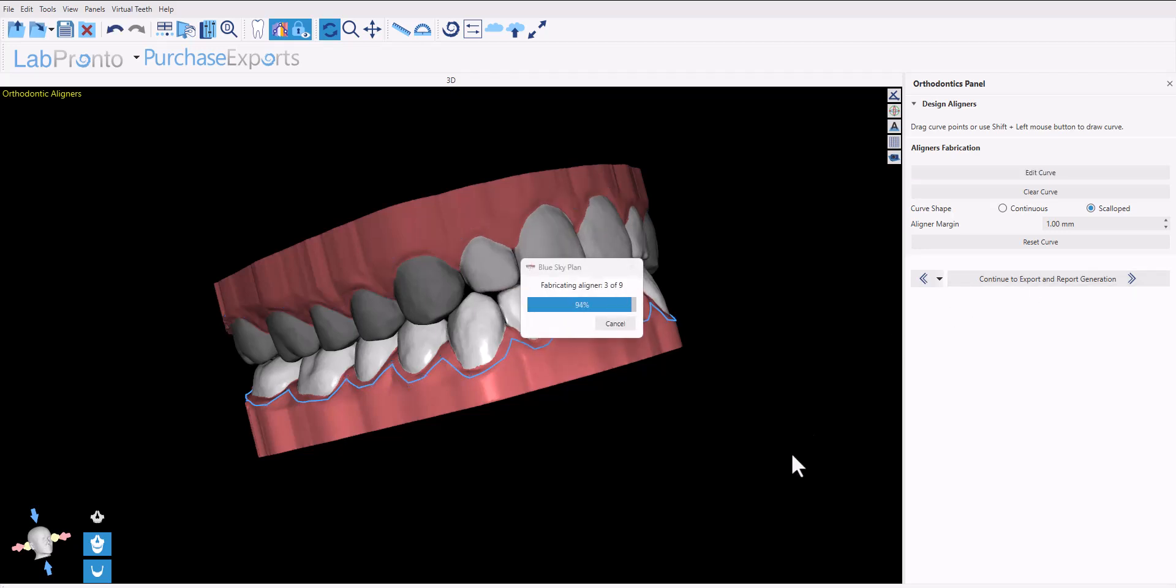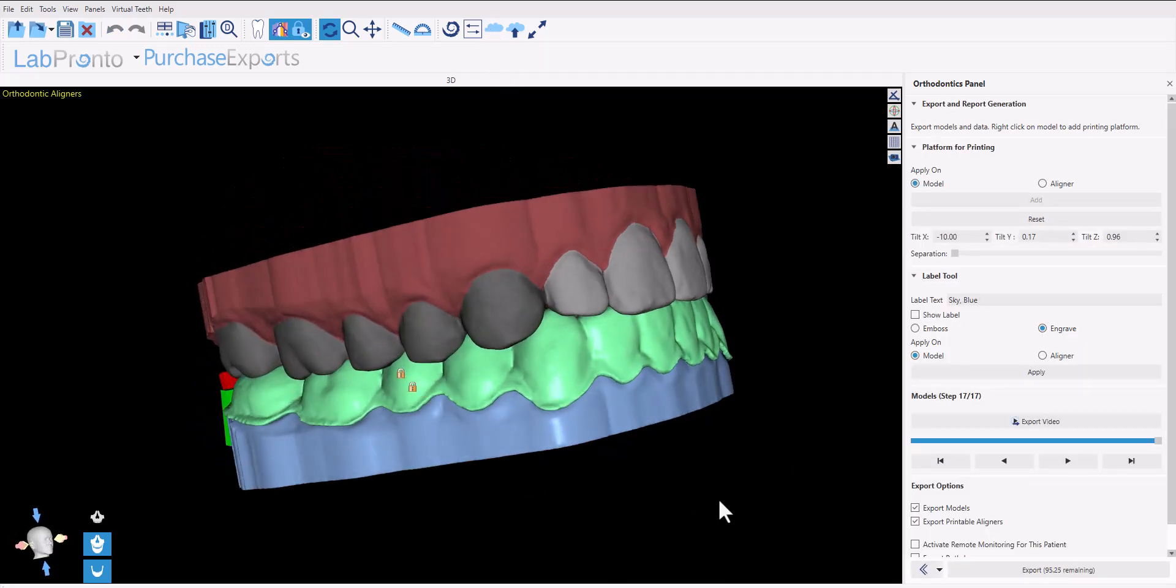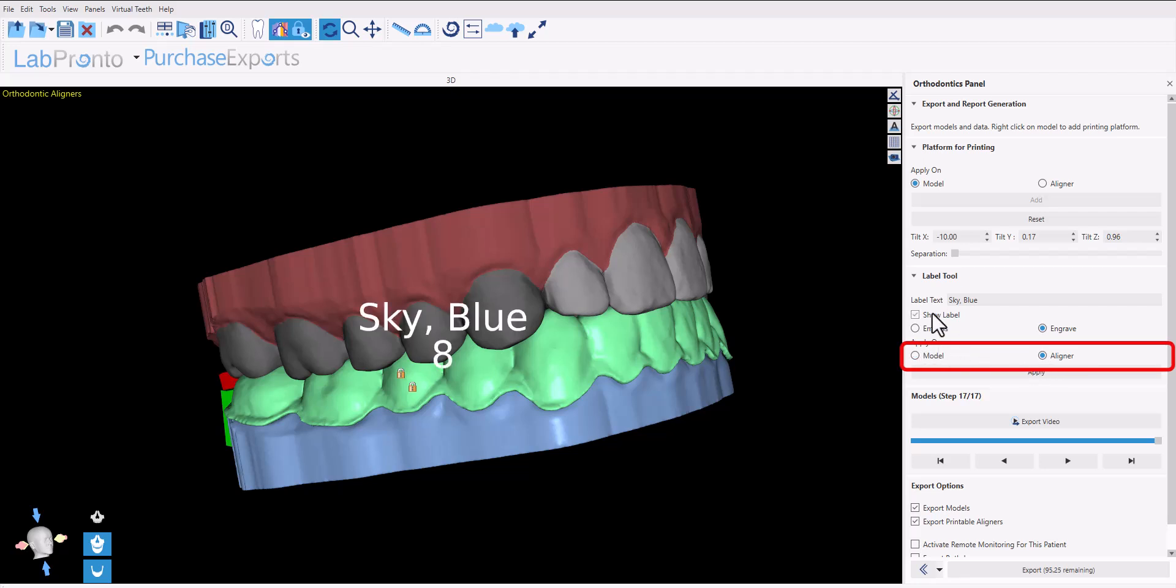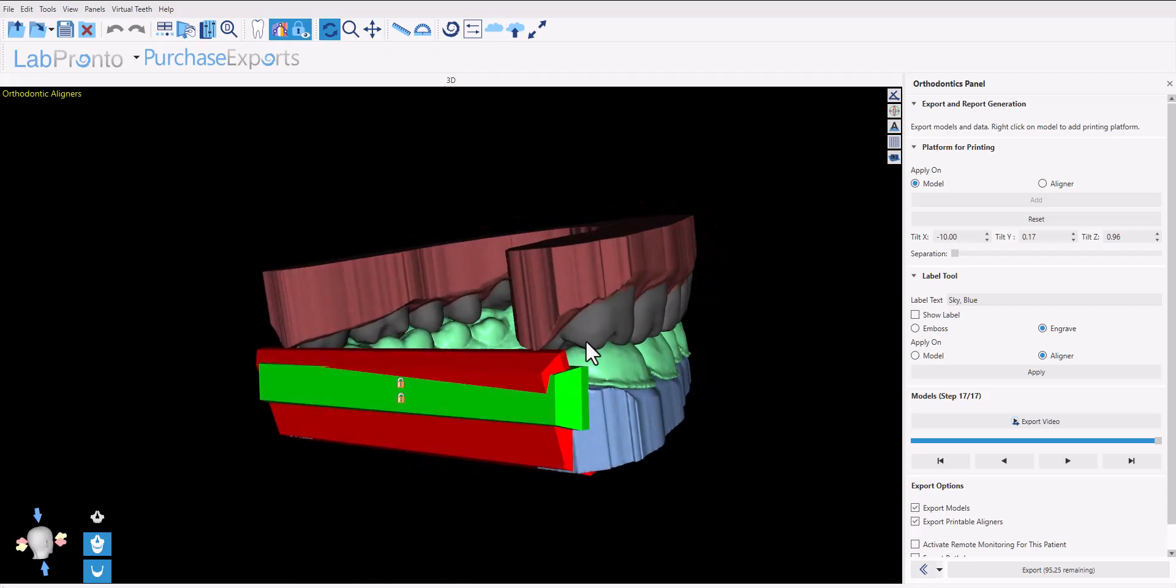You now have the usual options to emboss or engrave - you can emboss or engrave both on the model and directly on the aligner. Simply click apply and switch to aligner.